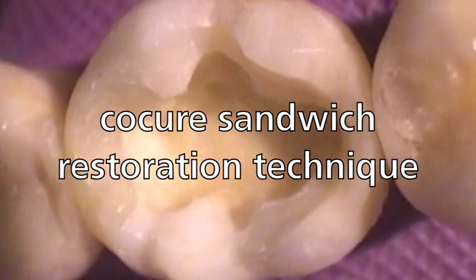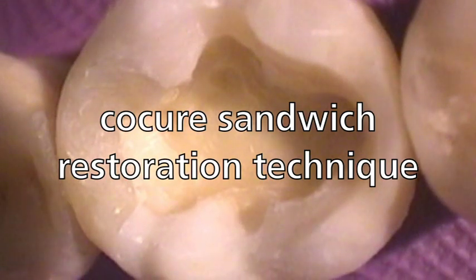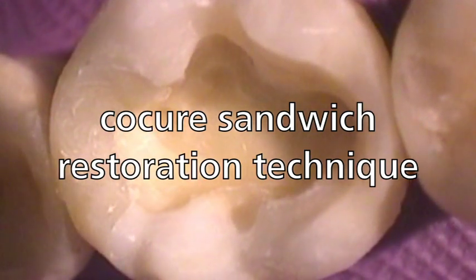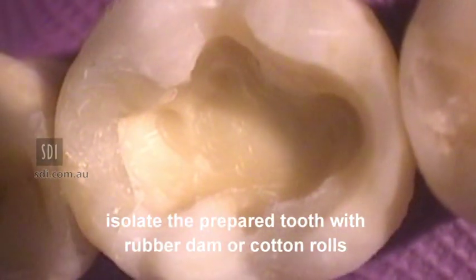Co-curing with Reva Bond LC and Reva SC or Reva SC HV. Isolate the prepared tooth with rubber dam or cotton rolls.